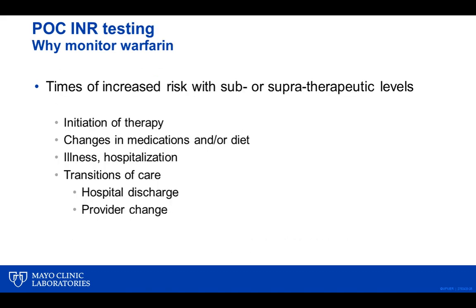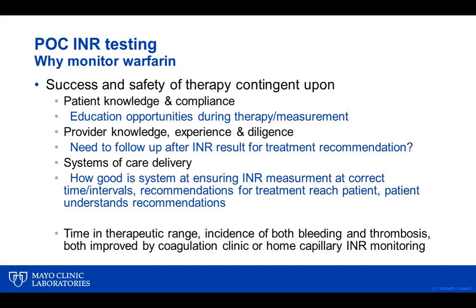So the times at risk of having too much warfarin or subtherapeutic levels are when we start therapy, when we change medications or diet, and when the patient gets ill. Hospital discharge and changing providers are all times of risk where lack of warfarin monitoring could lead to either bleeding or thrombosis. So we know that point-of-care INR programs work.